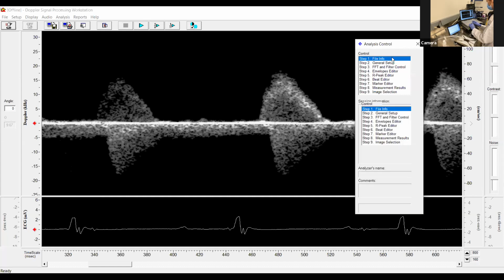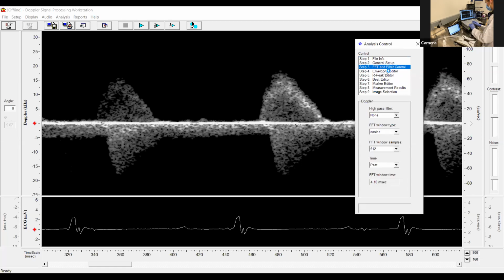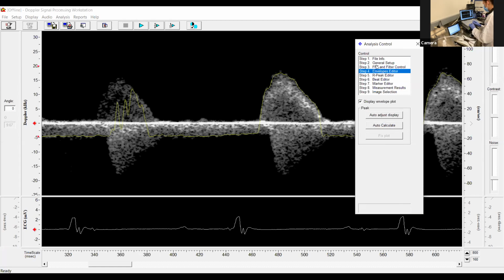Can you do a simple time interval? Sorry, I popped this on, Sydney.